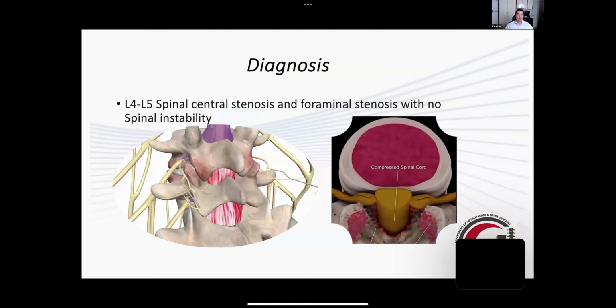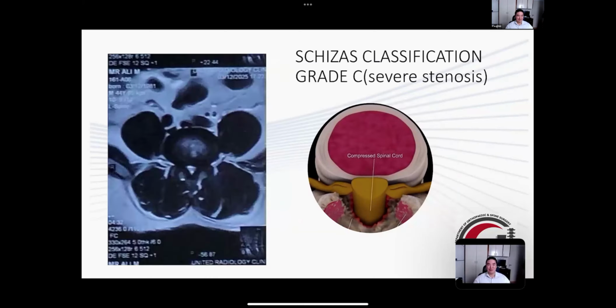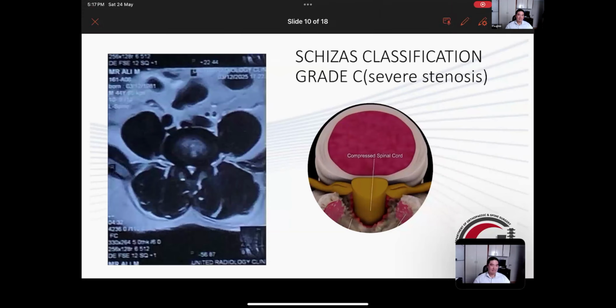Yeah, and if you go to social media, you can see a lot of people showing cases, even in spine meetings, with facet amputation, sometimes with the disc destroyed. It's pretty common to see that, especially on social media. So one of my questions is about this case. In such cases where a hypertrophic ligamentum flavum is the main cause of the stenosis, do we have to go into the disc space to remove the disc also, or not?